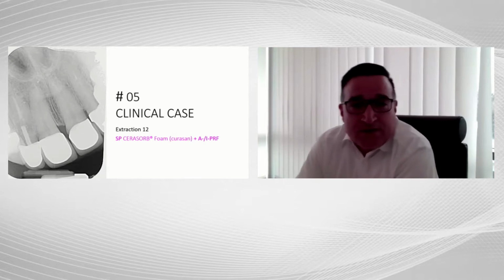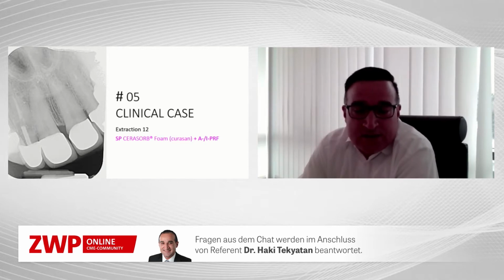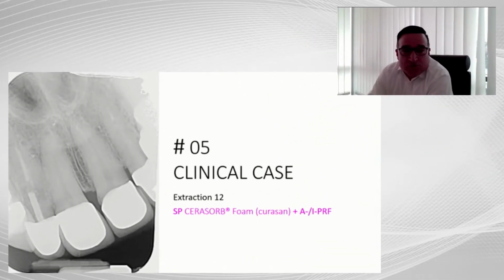The A-PRF, or low-speed centrifugation concept developed by Professor Shahram Ghanaati from the University of Frankfurt, is meanwhile a very biological method that we regularly use. We have very good experience in terms of wound healing, pain reduction, regeneration support. I don't want to go into further details here. I can only say that an evidence-based guideline by Professor Ghanaati's group is about to be published and will bring, I'm sure of that, a lot of scientific clarity regarding the topic of blood supporting methods.